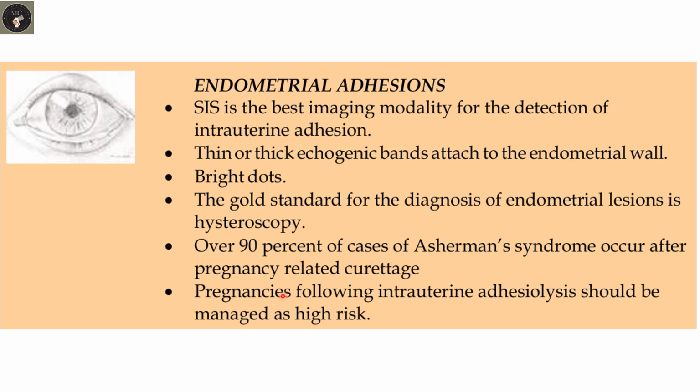Let's remember that pregnancies following intrauterine adhesion should be managed as high-risk pregnancy. At times, all you see are actually bright dots, but commonly thin or thick echogenic bands are seen, which are attached to the endometrial walls.